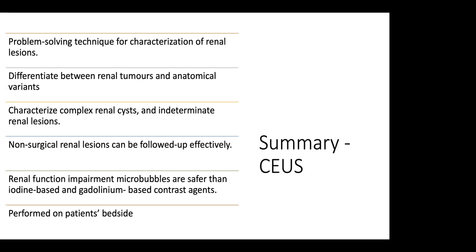We cannot see the liver even on grayscale by just keeping a probe on the right side. We have to see and respect the segmental anatomy of the liver. That is how the person doing the ultrasound is trained to take the images with respect to the distribution of hepatic veins and portal vein, so as to segment the different segments of the liver. And of course, for that kind of work, we need multiple injections for the evaluation of the liver.